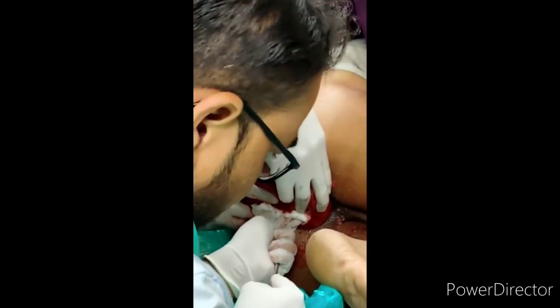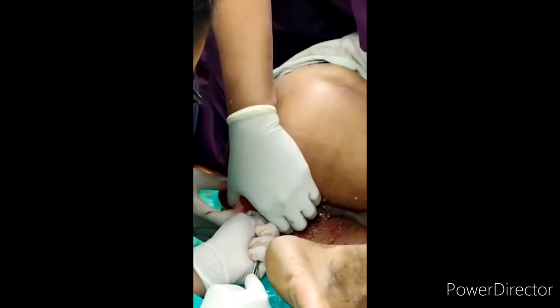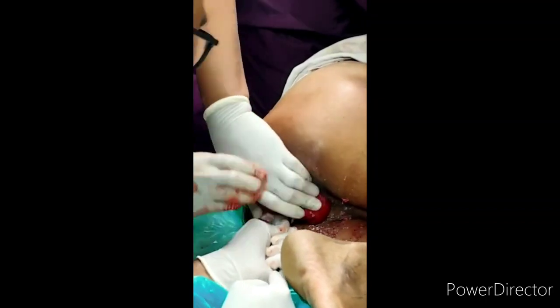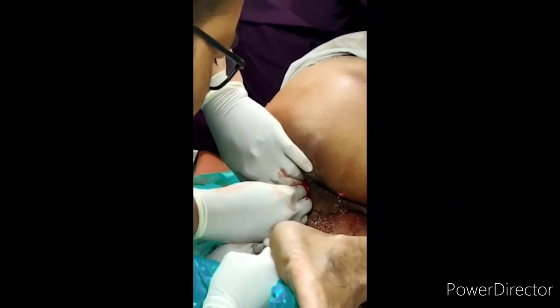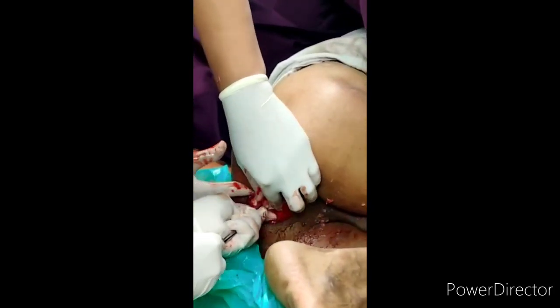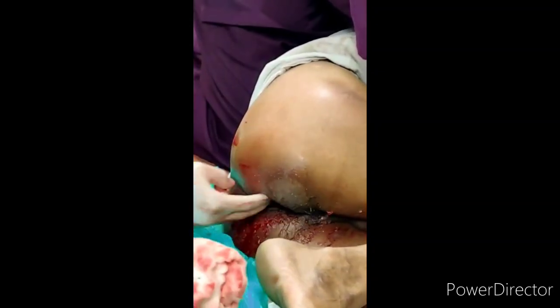We are able to reduce the rectal prolapse with the help of a mop held in the sponge-holding forceps and reducing it. Once it is completely reduced, we position the patient under spinal anesthesia for the Thiersch repair.